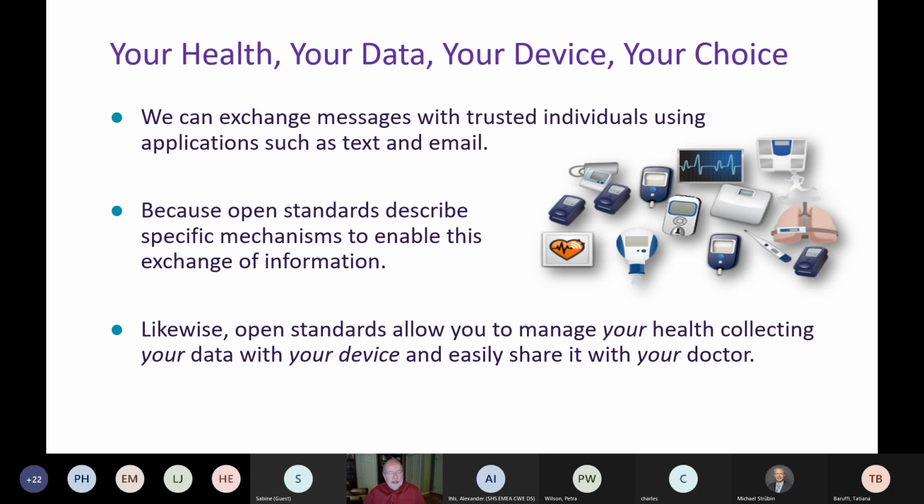they can communicate. And the reason that happens is the industry got together and said, hey, let's agree on a specific set of standards, a specific set of mechanisms that will enable this exchange of information. The same concept can be used with healthcare devices. So at the end of the day, an individual can choose their own device to collect their health data and share it with their doctor and their hospital. Next slide.